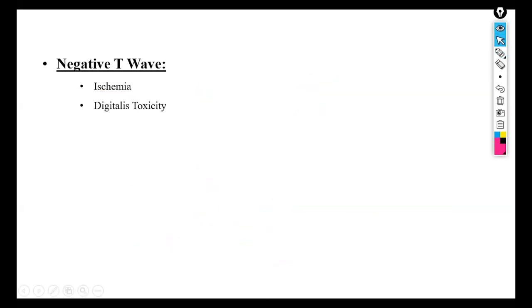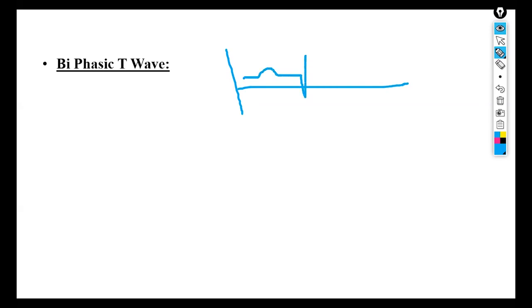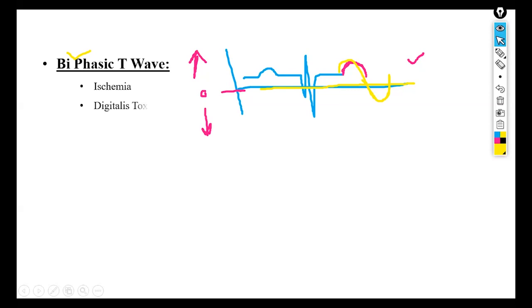Digital (digitalis) toxicity has the same effect as ischemia and also causes T wave negativity. A biphasic T wave is one that lies on both phases — above and below the zero line on the voltage-time graph. When a wave crosses both above and below the zero point, it is called biphasic. A biphasic T wave can be caused by ischemia or digitalis toxicity.